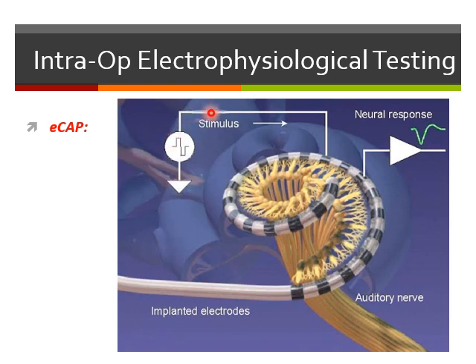If we give an electric current to one electrode like that, this electric current will cause direct stimulation of the spiral ganglion: the dendrites of the spiral ganglion, the cell bodies of the spiral ganglion, and the axons of the spiral ganglion. This stimulation will make a depolarization at the neural membrane of the ganglion. This depolarization will generate an action potential.